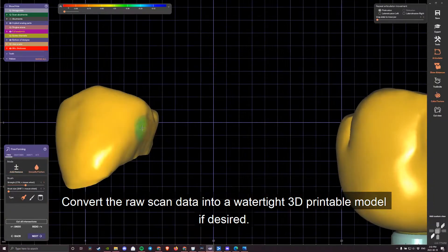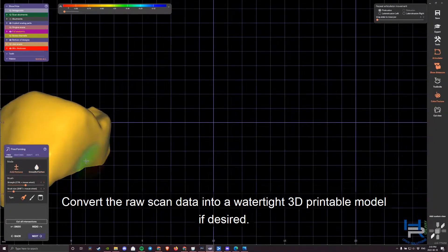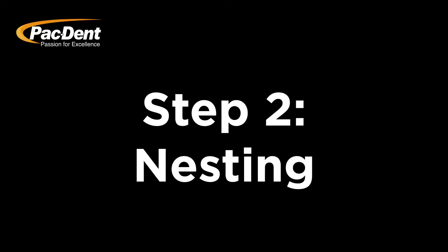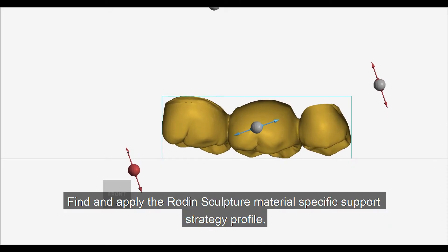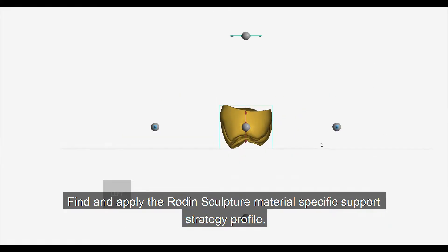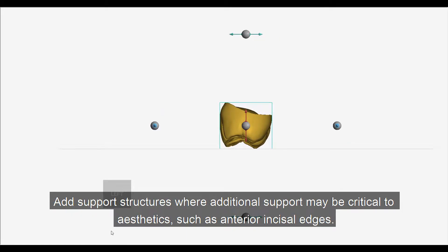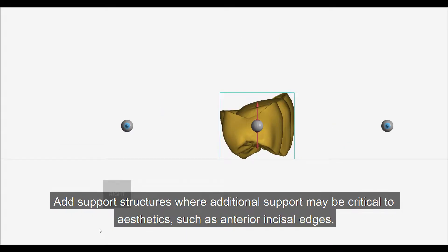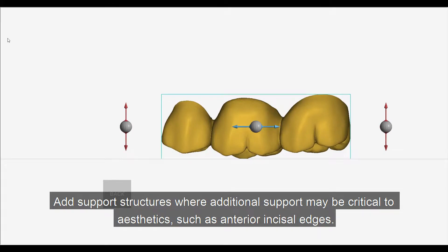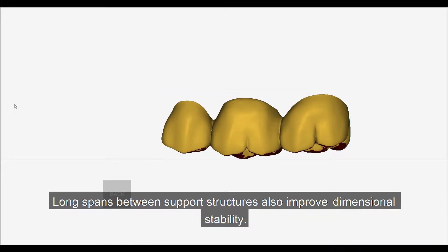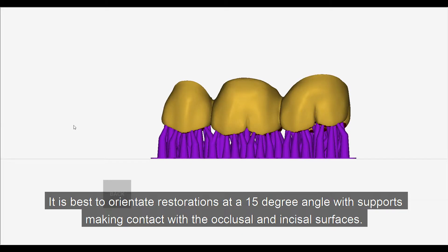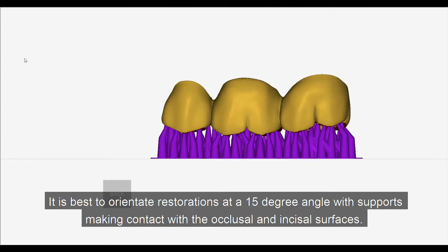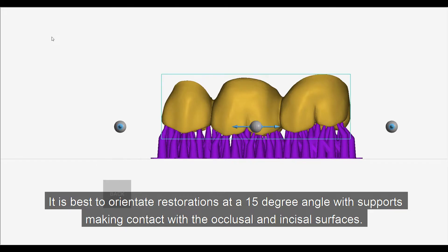Convert the raw scan data into a watertight 3D printable model if desired. Find and apply the Rodin Sculpture material-specific support strategy profile, and add support structures where additional support may be critical to aesthetics, such as anterior incisal edges. Long spans between support structures also improve dimensional stability. It is best to orientate restorations at a 15-degree angle with supports making contact with the occlusal and incisal surfaces.